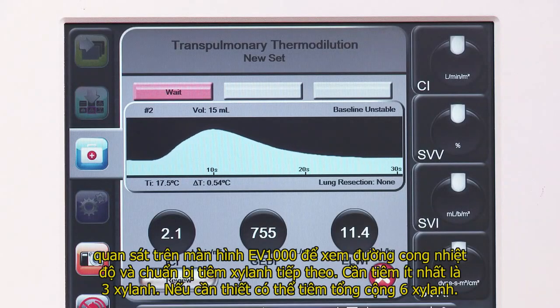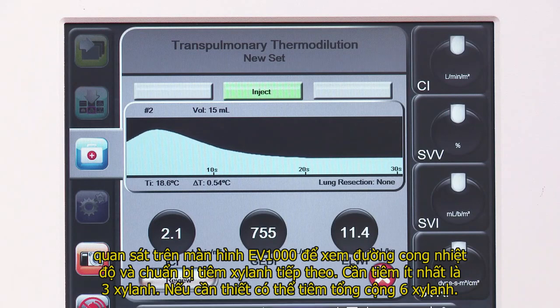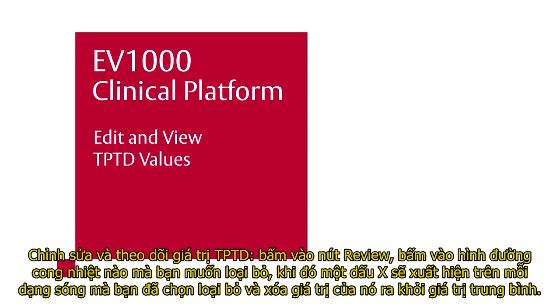Watch the EV1000 screen to observe the thermal washout curve and the prompt to perform the next injection. A minimum of 3 injections is recommended. If needed, a total of 6 injections may be performed. Edit and view Tptd values.